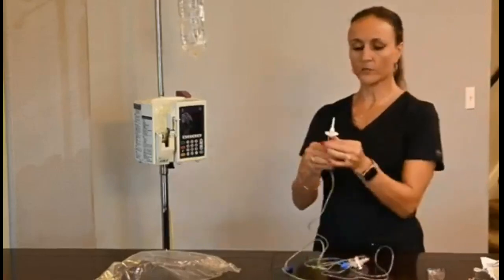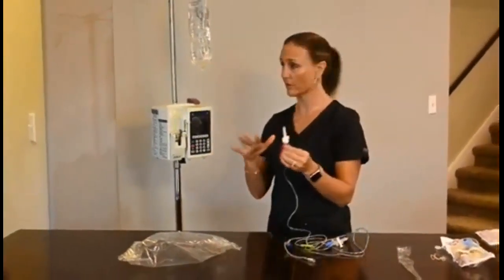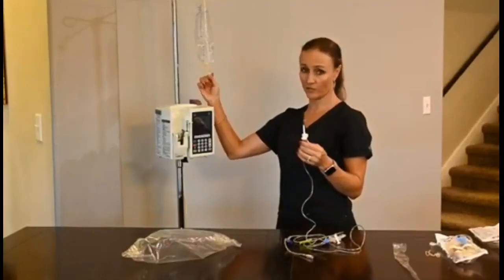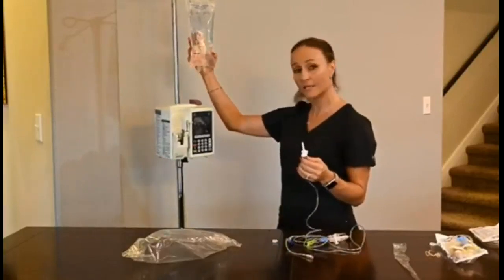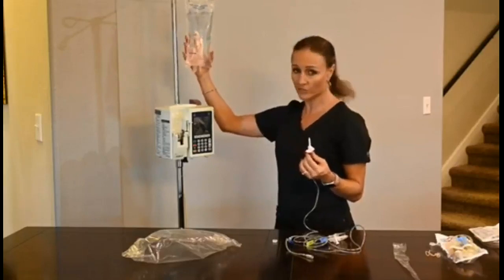This would have a cap on it. I would take the cap off and not touch this because this is considered sterile. Now I'm going to go to my bag, and what's going to be kind of different for you is that with these bags, there's a little magic trick. Are you ready to see it? I would pull this off, and look, nothing's coming out. Because this is a brand new bag, so until I spike it, I haven't broke the valve. When you're in lab, these bags are going to be used, so the magic trick won't work.